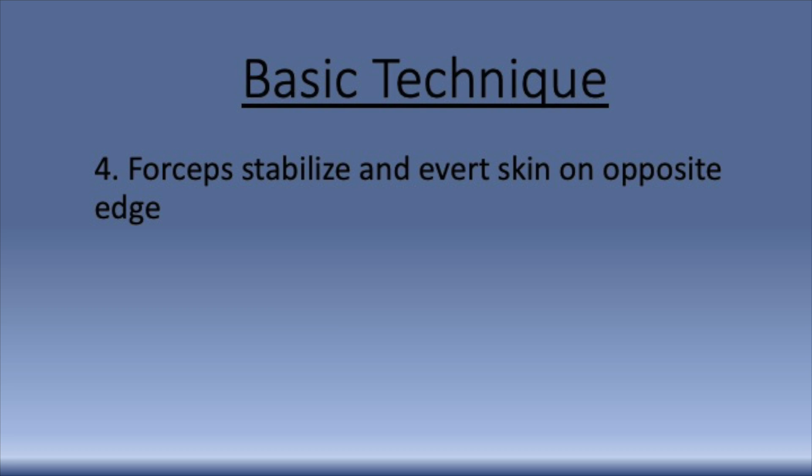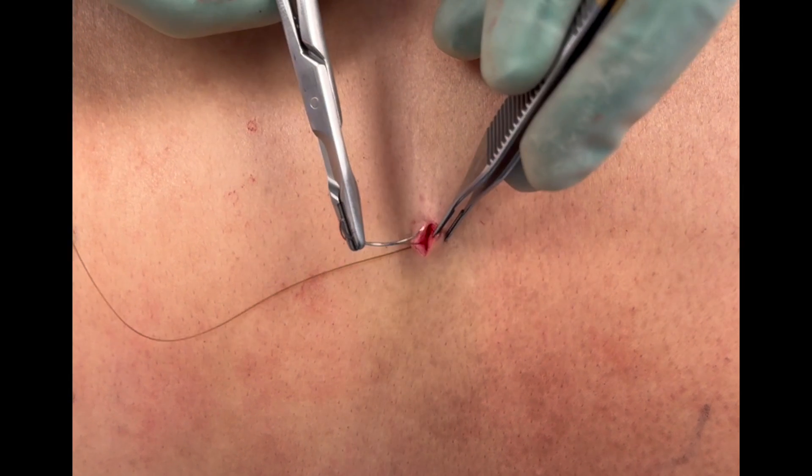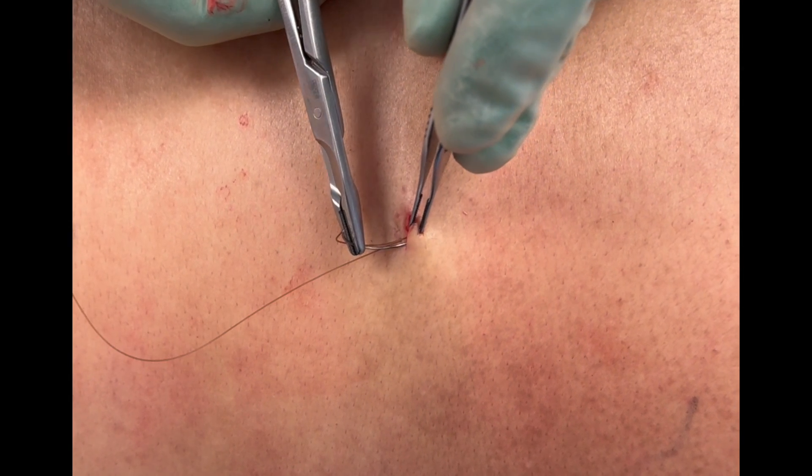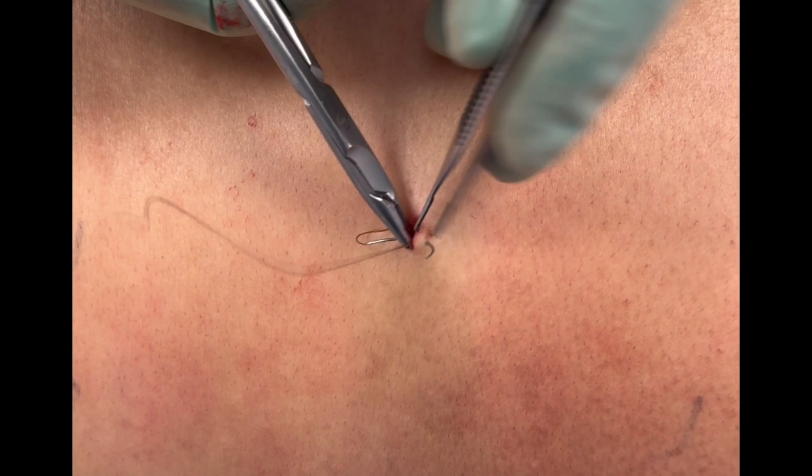Next, the forceps stabilize and evert the skin on the opposite edge of the incision, just like in step one. The needle is then rotated through the skin, always following the curve of the needle. The suture is pulled through and the knot is tied.